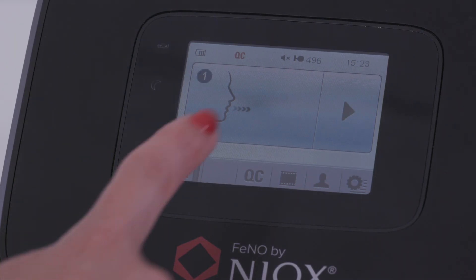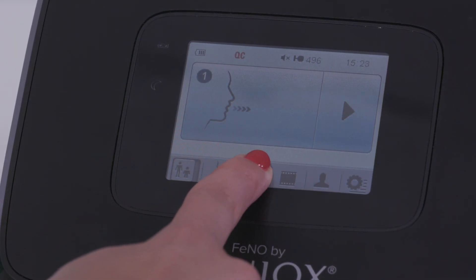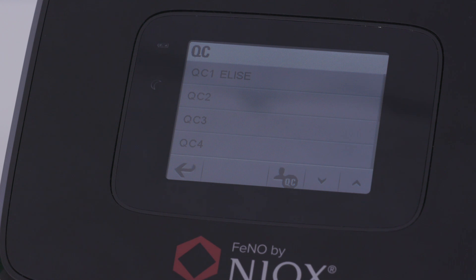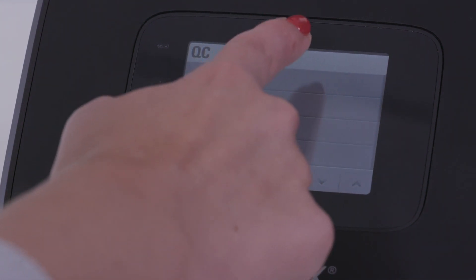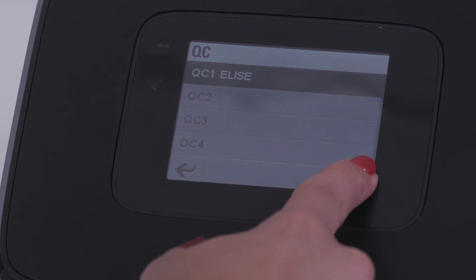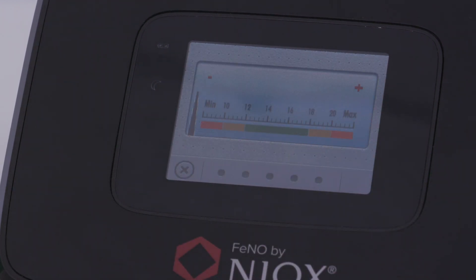To perform a QC measurement, touch the QC icon on the device's home screen. Then select the QC user by touching the name listed and touch the green play button.